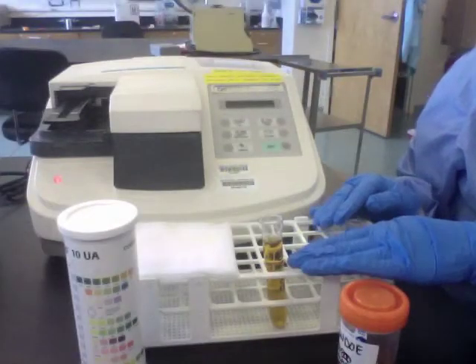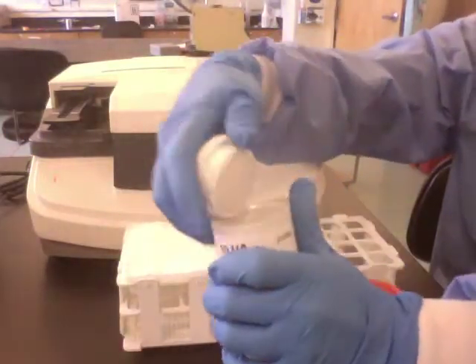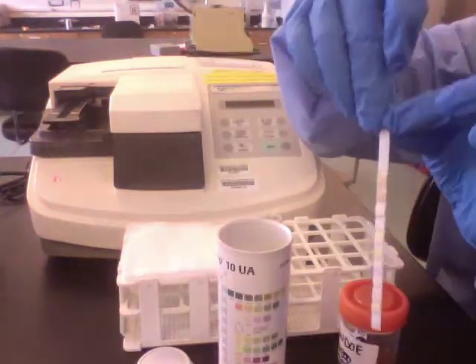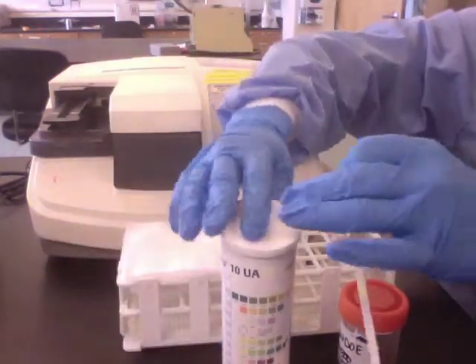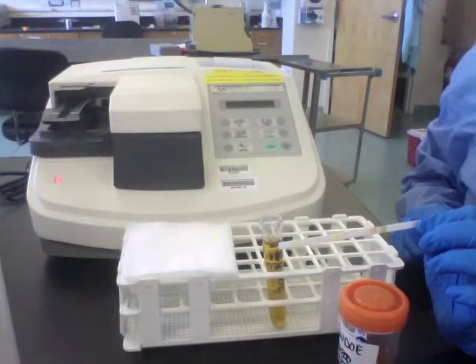Once you have your specimen all prepared, prepare your strip. Remove it from the pack, handling it by the handle. Replace the desiccant pack immediately. Once you have your strip ready, you can press Start.